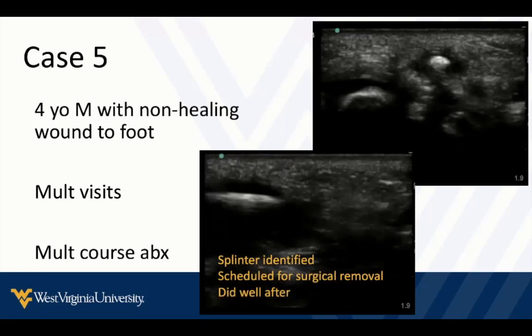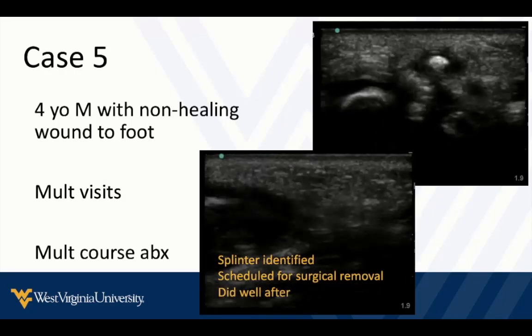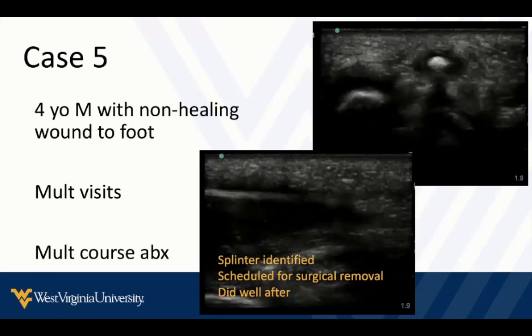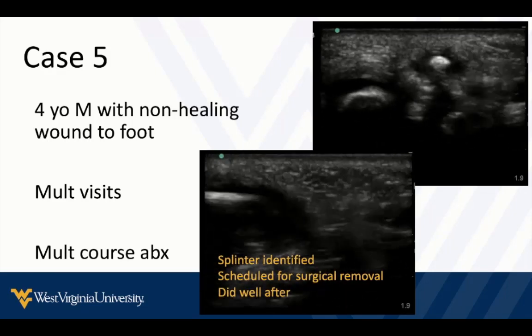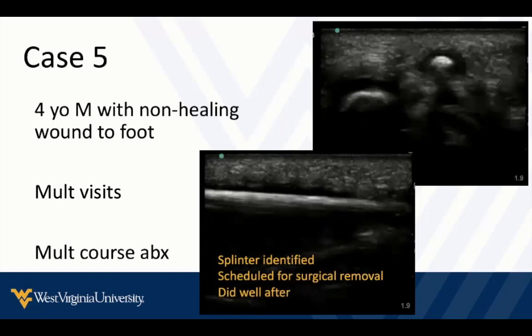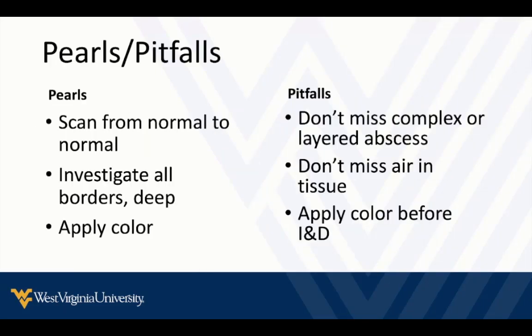And this kid finally, after over a month of antibiotics and kind of misdiagnosis, was able to have this removed within a week, was doing great and walking around again. So again, ultrasound would have been nice to apply early in this patient's care, but at least finally, by incorporating it into this patient's care, we're able to make an accurate diagnosis and give proper care to this patient.